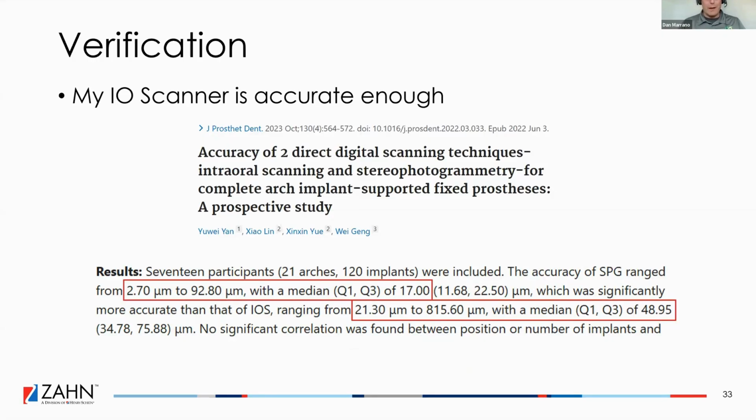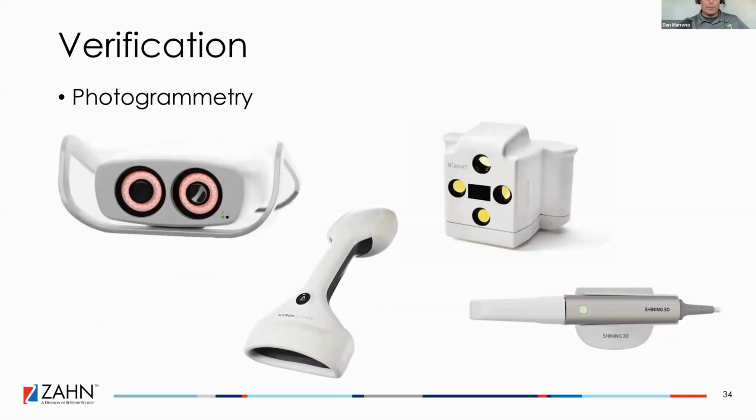So keep that in mind as you're maybe being told, oh, I can just use my scanner. We have plenty of examples, especially when you're aligning photogrammetry, where you'll see the stitching of the intraoral scanner have kind of gone off track. And thankfully you have that photogrammetry for it, or if you don't have photogrammetry, you would have your jig.